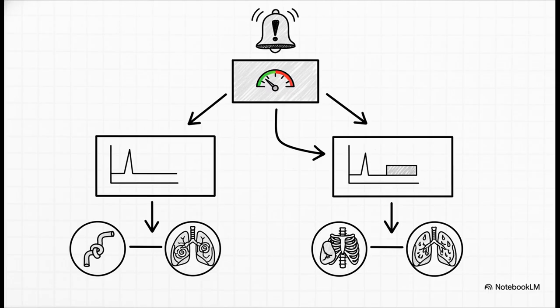However, if both the peak and the plateau pressures have risen together, the problem is decreased compliance of the respiratory system. Think tension pneumothorax, pulmonary edema, or abdominal insufflation. It's a powerful diagnostic tool.